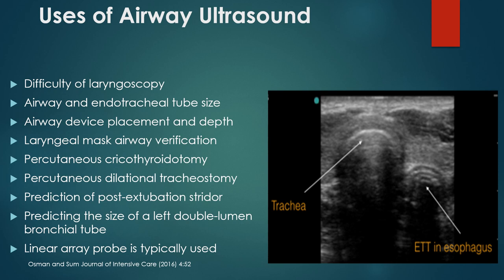I do a lot of double-lumen tubes, and I'm not real sure that I'm going to have much utility for this. But again, if you can get some bronchial measurements or at least some tracheal measurements, you have a good idea about how big a tube you can accommodate. And we got a couple of examples coming up here.